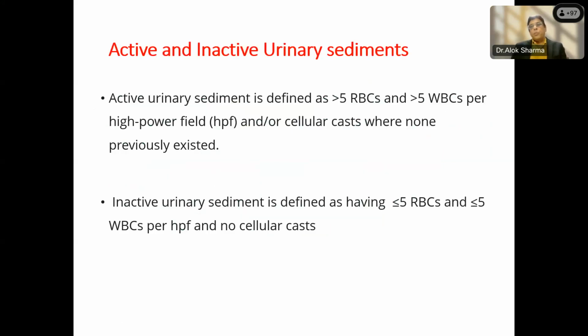So moving on. You will have heard of these terms a lot. What is an active sediment? When you get requisitions from clinicians, you would get, "Please comment on the activity of the urinary sediment," or you would just get a requisition saying "urine for active sediments," right? So you should understand what an active sediment means and what an inactive sediment means.